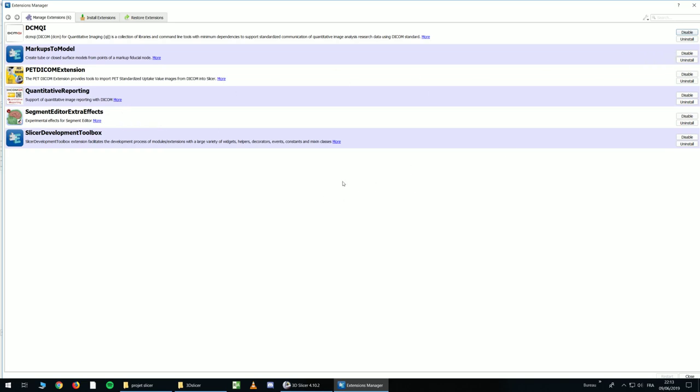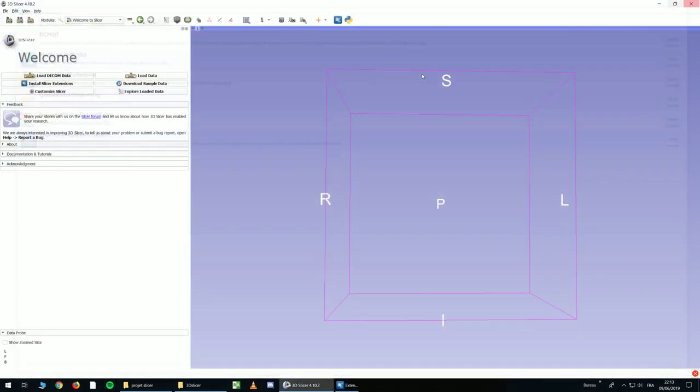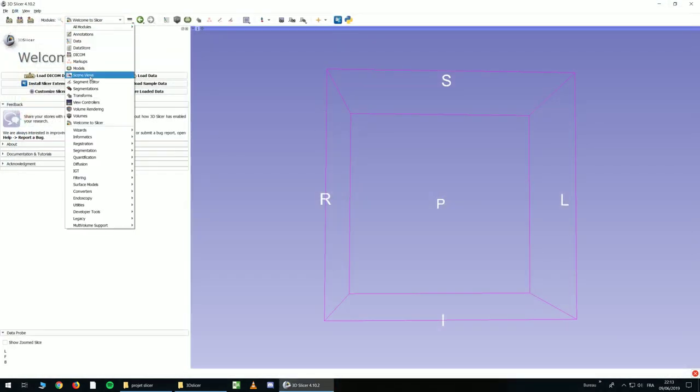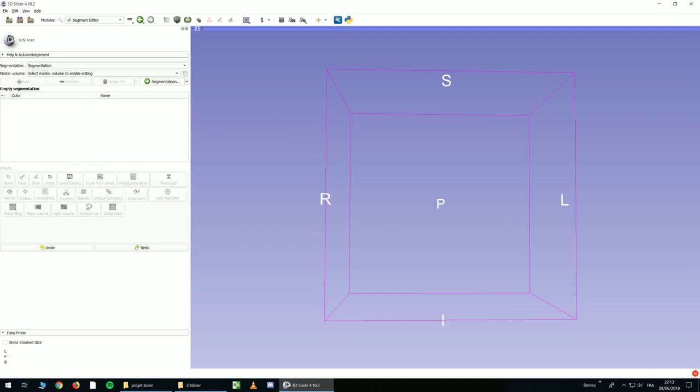Once it's done, you need to restart 3D Slicer, and you can go to Segment Editor. If you install the extensions, you will have something like this. If you don't, you will have less tools.